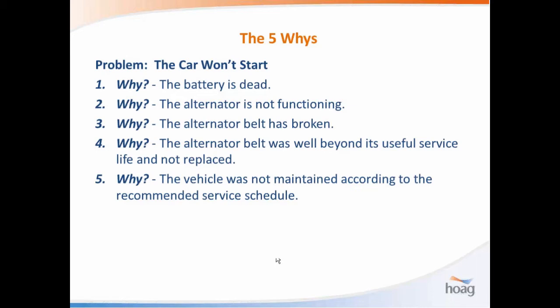It wasn't the battery being dead. It was the preventative maintenance not being done. And in this case, the systems improvement would be to make sure the preventative maintenance gets done. So keep asking those whys to drill down till you get to the ultimate answer.